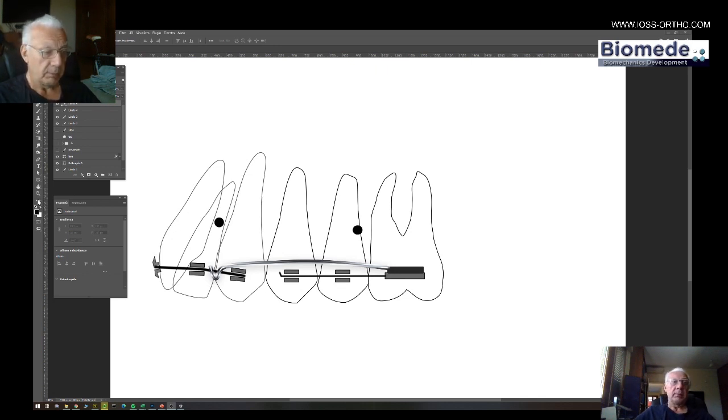And it cannot be just answered with a couple of words or with a few lines on Facebook. So I just had to create this short video to give my analysis of the problem. We need to analyze and estimate the dental displacement that the reactive unit would have due to this mechanics and reaction force system that is delivered to the reactive unit.